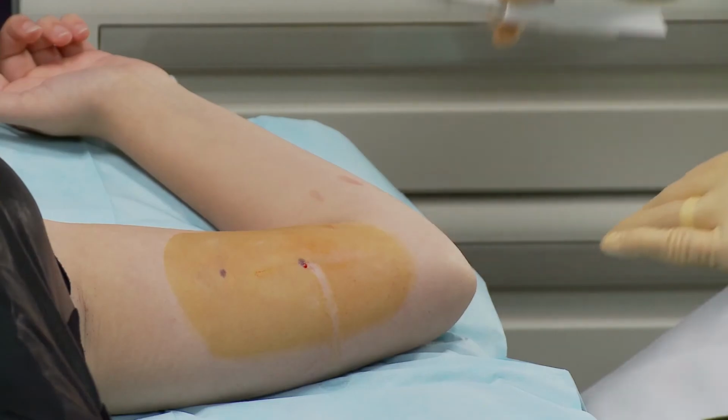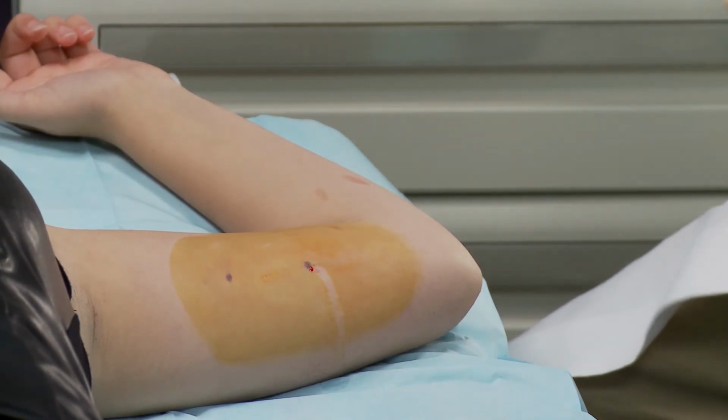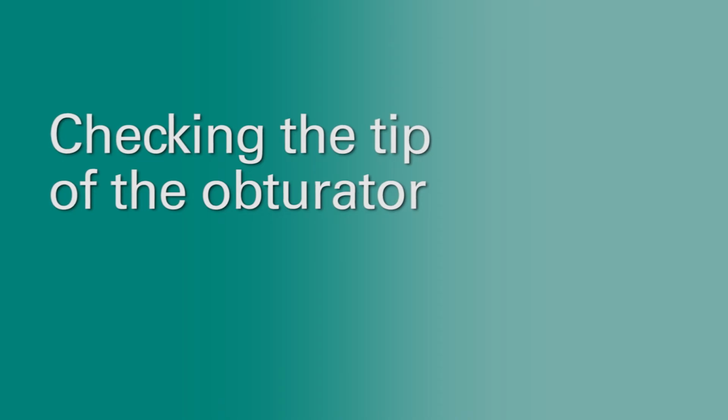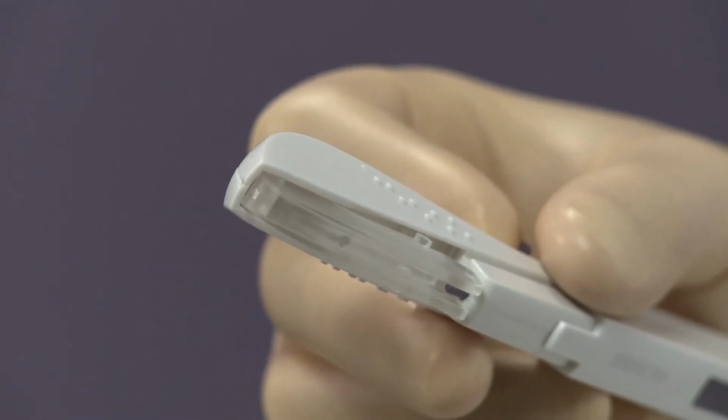If the applicator is not kept in the same position during this procedure, or if the purple slider is not completely moved to the back, the implant will not be inserted properly. To ensure the insertion was performed properly, check to see that the needle is fully retracted into the body of the applicator. Only the purple tip of the obturator should be visible.